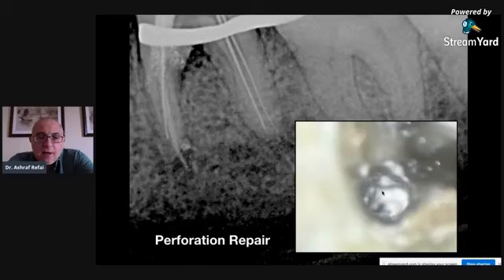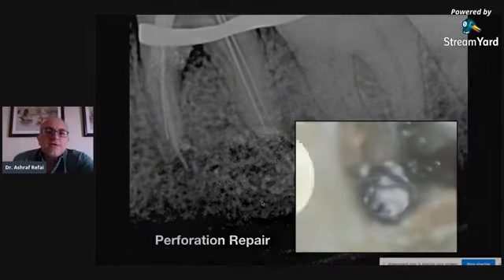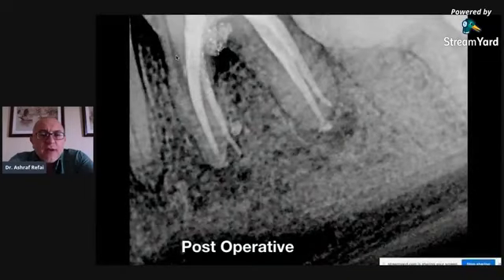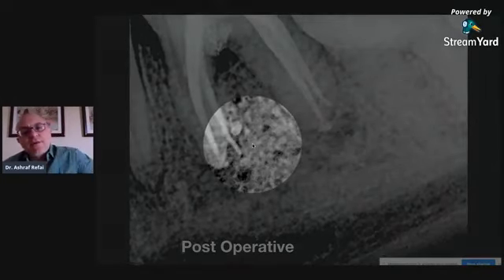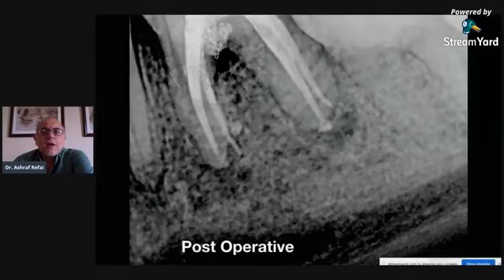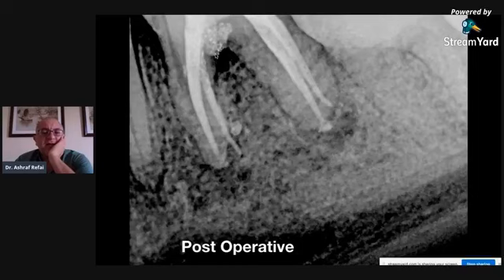And then I repaired the perforation, and these are my master cones, and I started doing the distal canals. I was concerned mostly about that area and repairing that perforation. So I placed in a temporary gutta percha cone to act as a place maintainer during the perforation repair. And then this is my post-operative. Although with my best efforts, I had overextended for about 1 millimeter. But as you can see, I did repair the perforation here, and I'm looking forward to following up these cases in the next few years and to see how much bone loss happens in the furcation area.